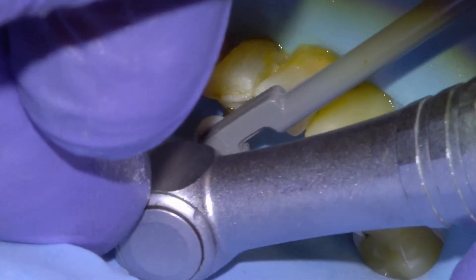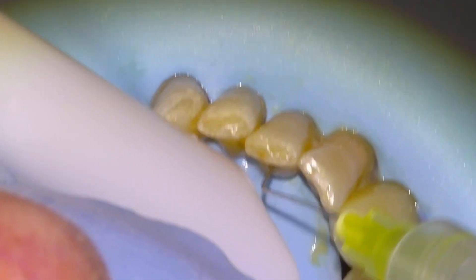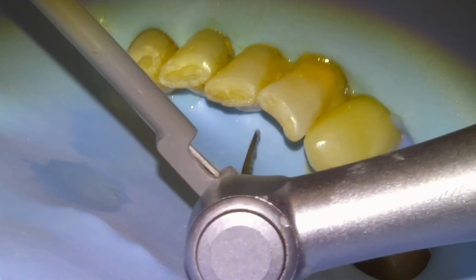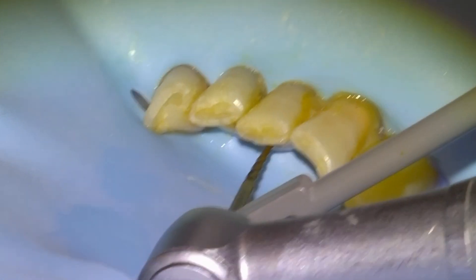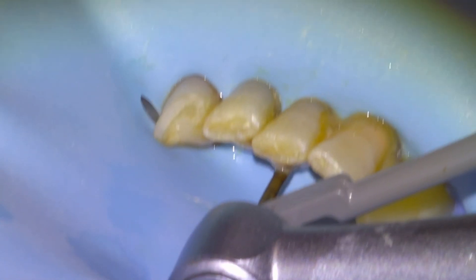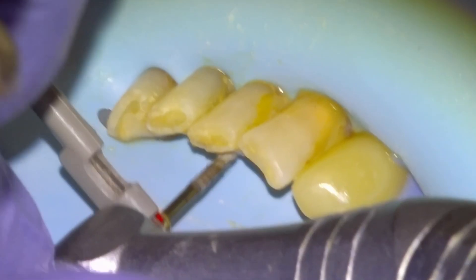We'll take our S1 to length and irrigate using RC prep. I think this is going to be the 25-06, so this is the second to last file that we'll take to length. For necrotic cases it's super important to sterilize the apex.